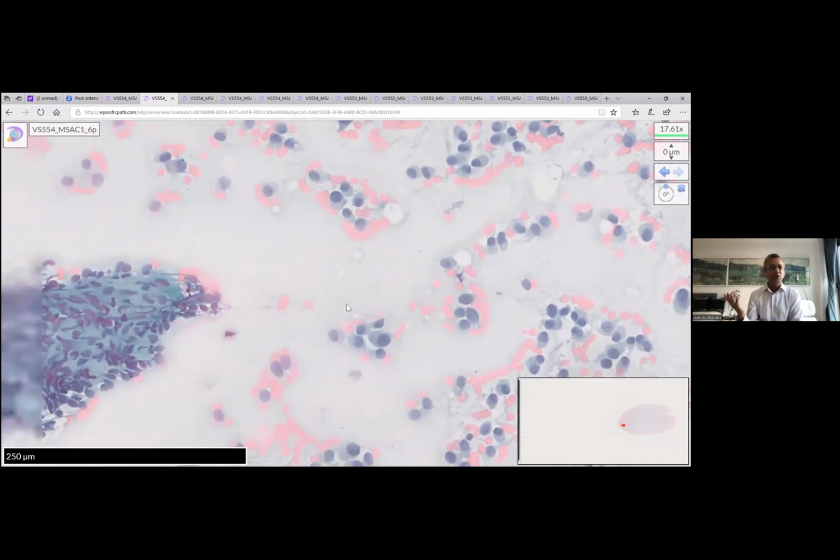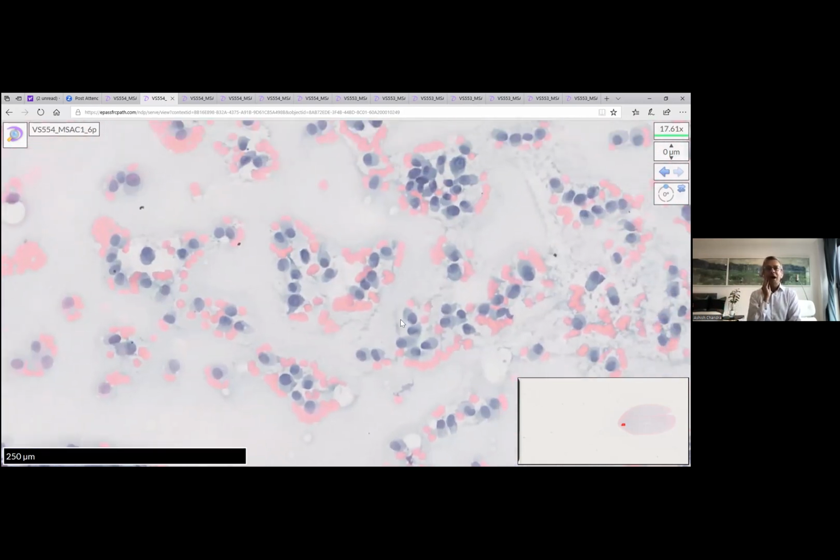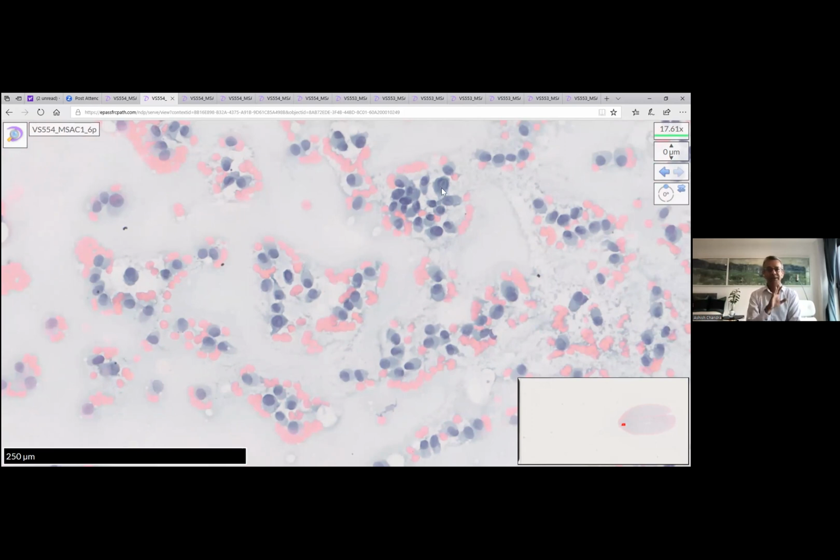Obviously, in this setting where we're only giving you a few seconds to come up with your differential diagnosis, that's perfectly okay. In a test setting, I would say the best mark would be for melanoma being at the top of your differentials, because lobular carcinoma will tend to have less cytoplasm. They tend to be smaller cells, and the nucleus tends to be filling up the cell. I think you're probably thinking of a plasmacytoid carcinoma of the breast. That's a very rare diagnosis to make.